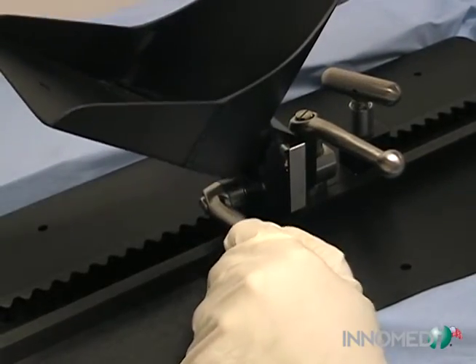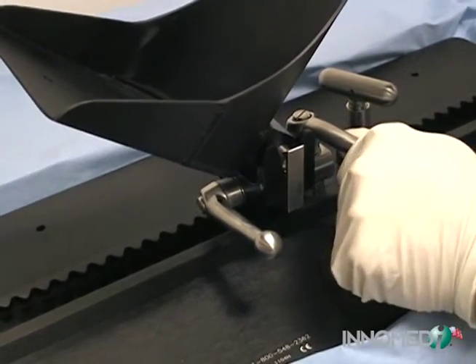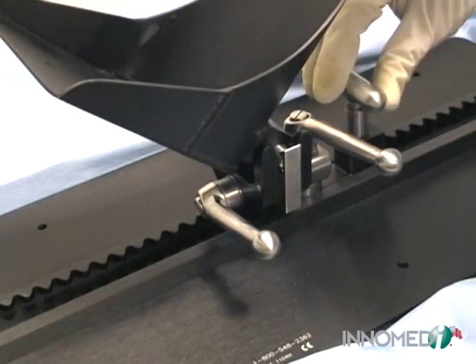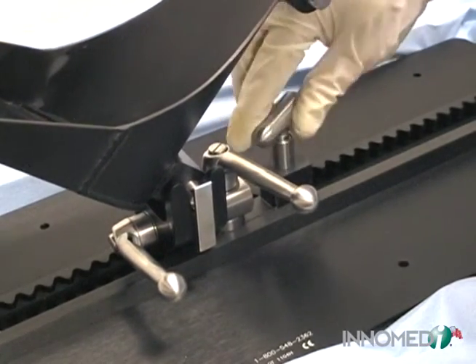The Assistant Free Stilberg Leg Positioner has all the adjustments needed to tilt, rotate, or change positions of the knee during surgery. The versatile yoke system allows for slow, more precise adjustments as well as quick adjustments. The entire unit is steam or gas sterilizable.